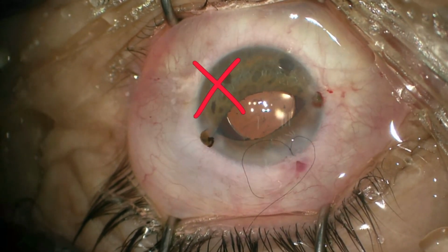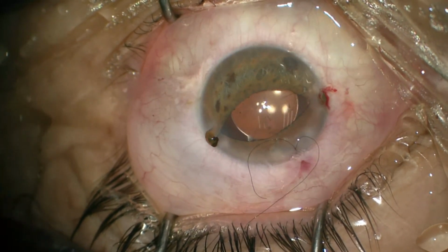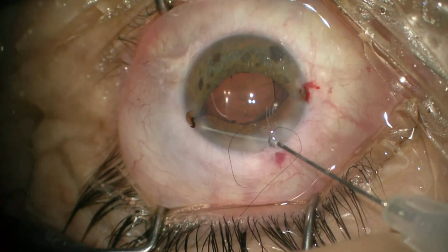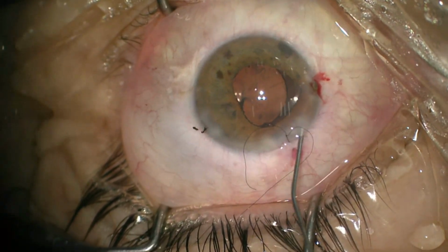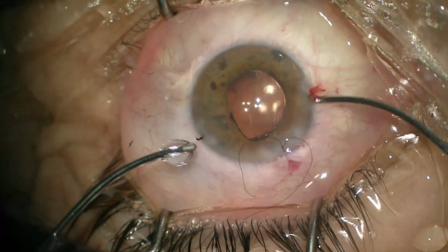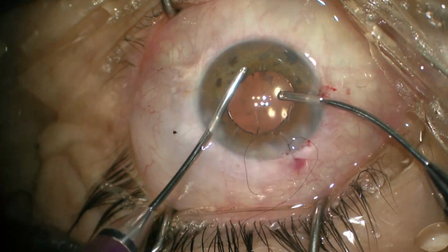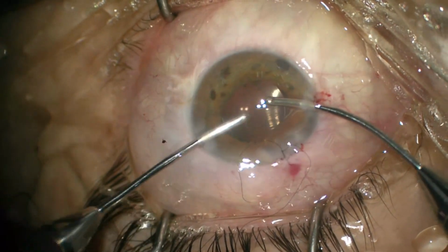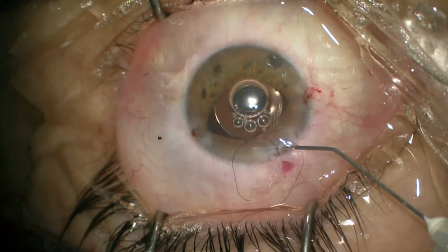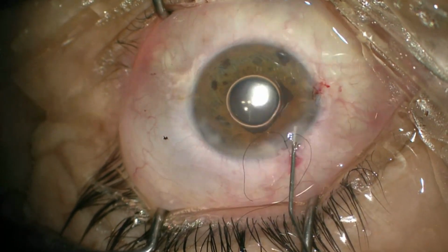So my advice at this point will be to leave a small piece of cortical material. This will not be the end of the world, and being so obsessive about removing everything in the last steps of the surgery can complicate it and prolong it in ways you don't want to deal with. Because here, again, you need to put more viscoelastic and go again inside the eye with the irrigation aspiration probe, and more trauma and more manipulation will eventually inflame the eye. So removing the viscoelastic and applying Miochol at this point to close the pupil will be very helpful.